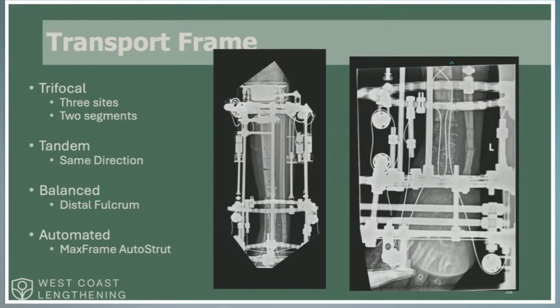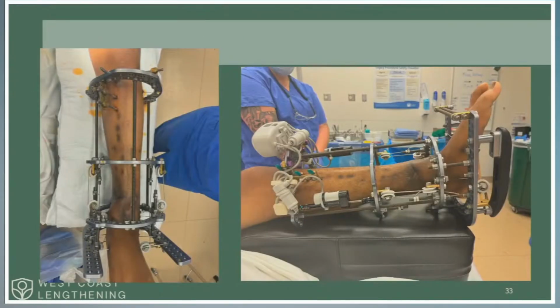This one here goes down and around, and it's a series of pulleys that makes all set up to this motorized unit. So this ring is going to move up. It's going to tension the cables around and pull down to fill in the gap. So we automate it. So that's what that looks like. Not too complex.